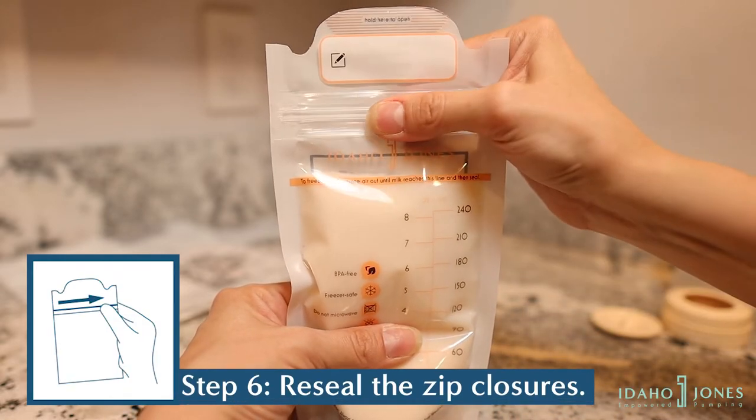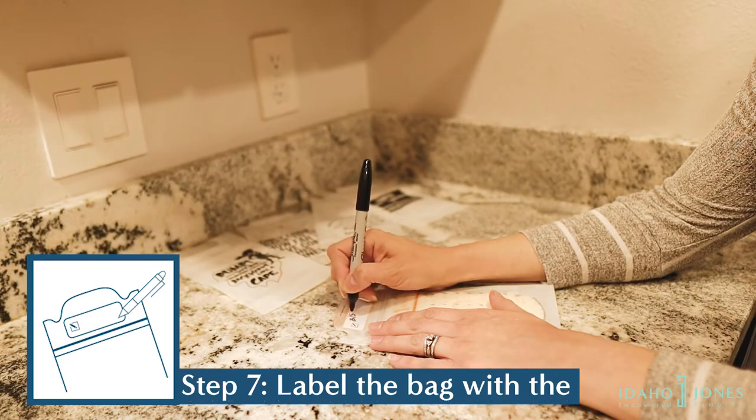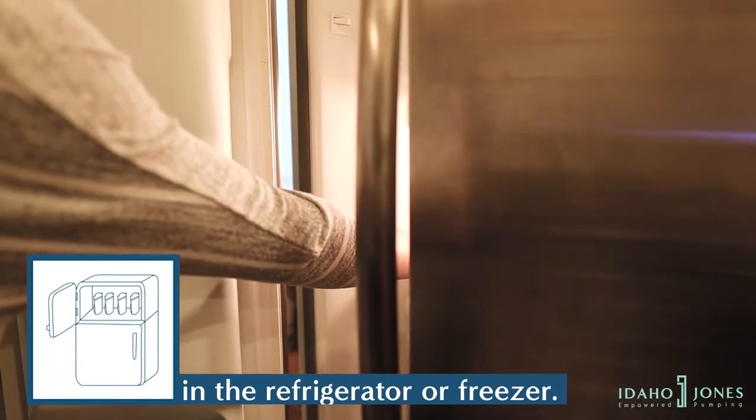Re-seal the zip closures. Label the bag with the date, time, and volume. The bags are fit for storage in your refrigerator or freezer.